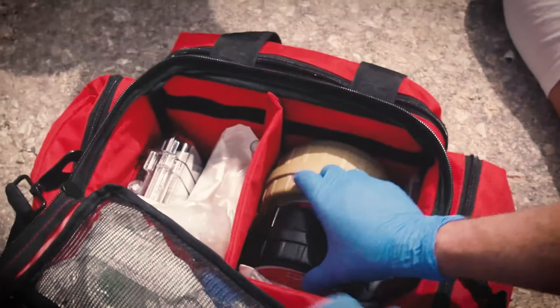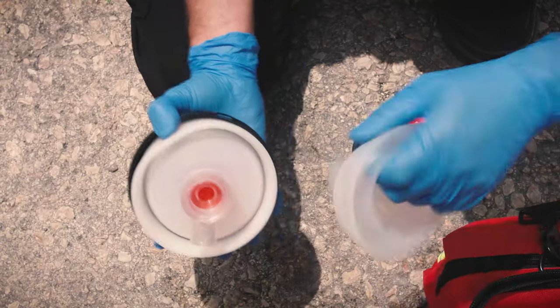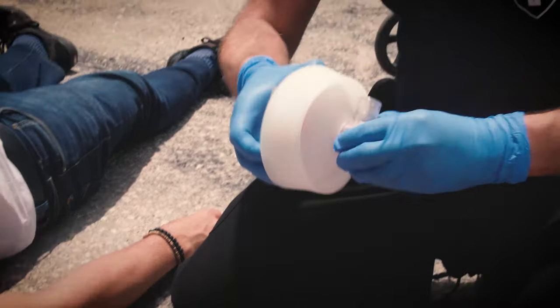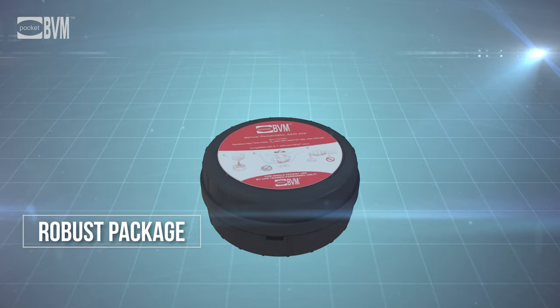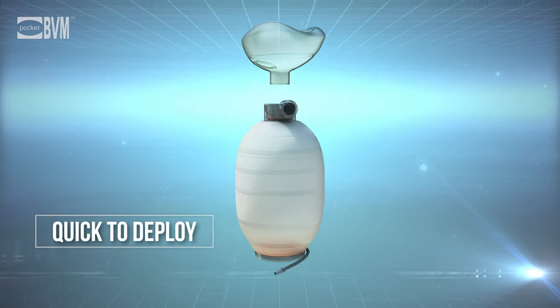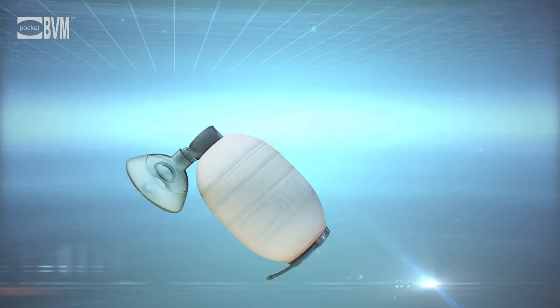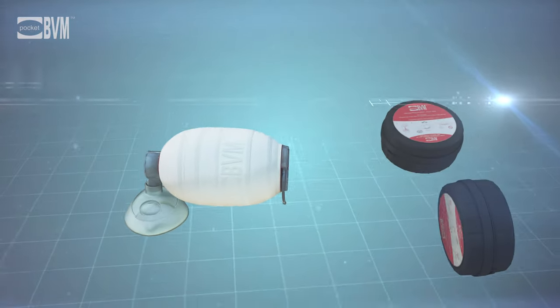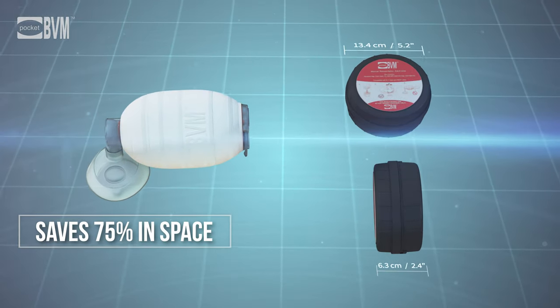The Pocket BVM is a revolutionary bag valve mask for manual resuscitation. The device expands from a small and durable package, making it the most compact BVM on the market. The Pocket BVM expands quickly and is easy to operate, and is 75% smaller than standard BVMs, saving valuable space in emergency kits.